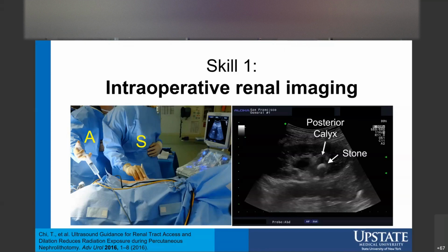Here on the right, we can see a kidney with the hypoechoic hydronephrosis and the hyperechoic stone. You can see posterior acoustic shadowing. And notably, anything that's towards your probe, towards the top of the screen, is going to be posterior, so that's nice. The other thing to consider is that you always want the head of the patient towards the left side of the screen. On this Aloka machine, that green dot signifies a dot on the actual ultrasound probe, and you can use that to line everything up.